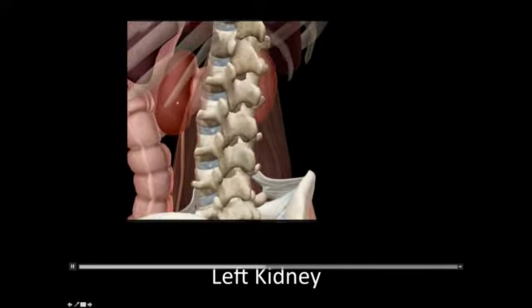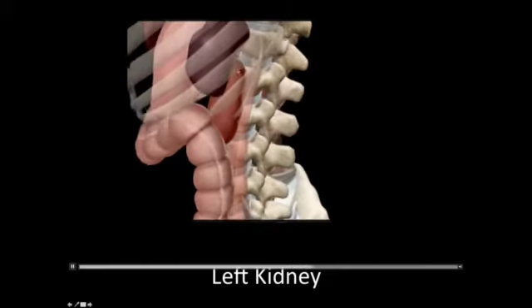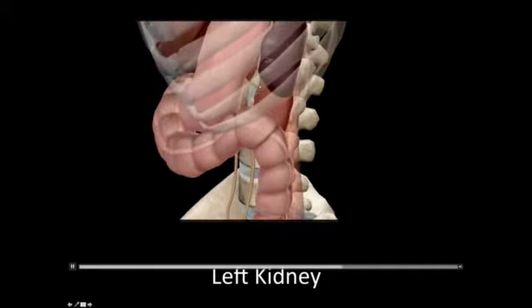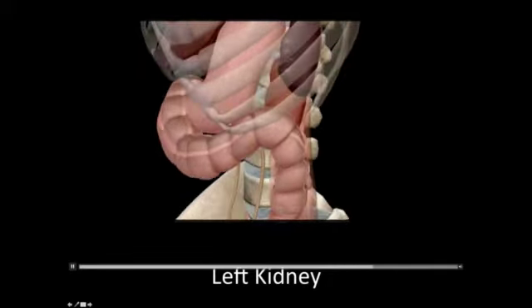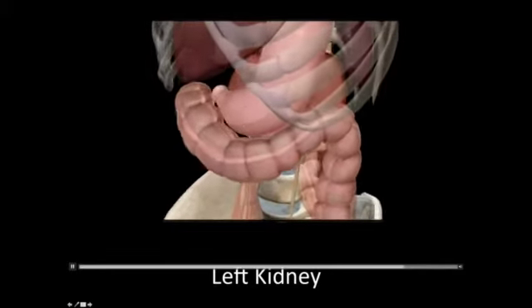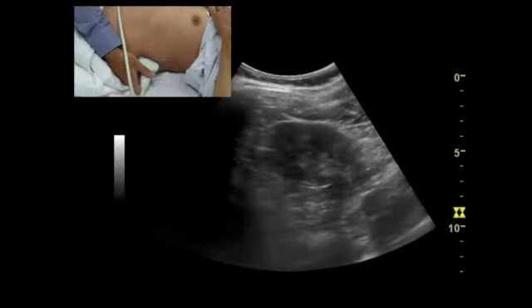You may have to roll the patient on their side or over and go through psoas posteriorly, or sometimes intercostally here. Probably the most common view is here, just cutting a bit through the spleen and looking even here to get a good view that isn't interrupted by this horrible air-filled stomach and colon. Okay, so you're going to put the probe almost on the patient's bed posteriorly to get an adequate view of the left kidney. And here I am doing just that.